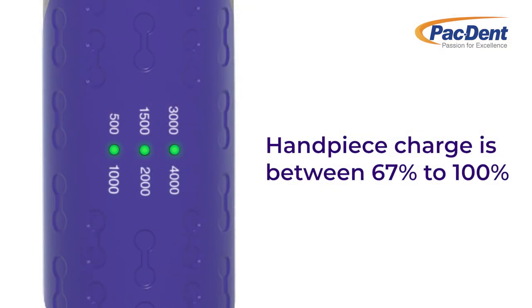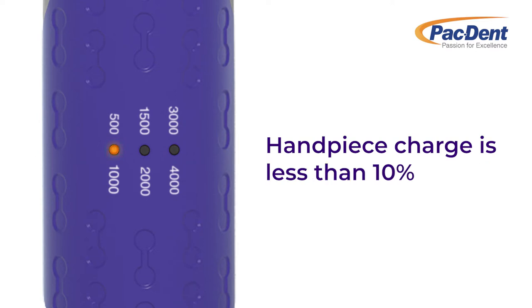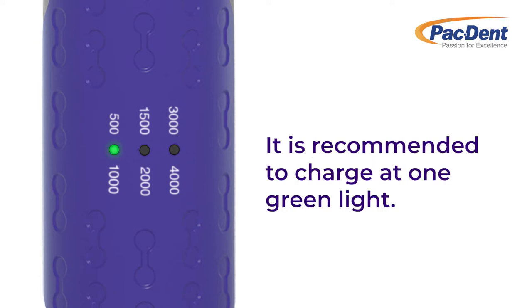When three lights are illuminated, the battery life is 67 to 100%. Two illuminated lights indicate 33 to 67%. One illuminated light indicates 10 to 33%. When the light is amber, battery life is less than 10% and needs to be charged immediately. We recommend charging your handpiece when it is at one illuminated light.